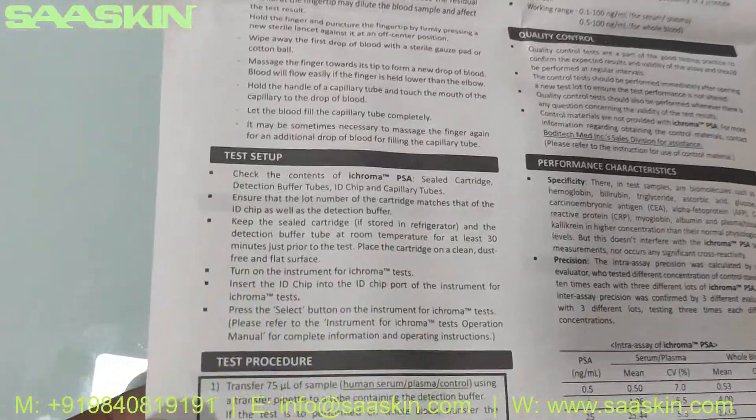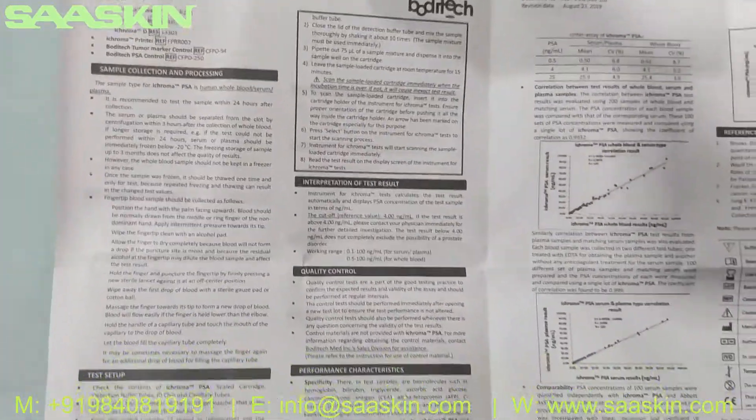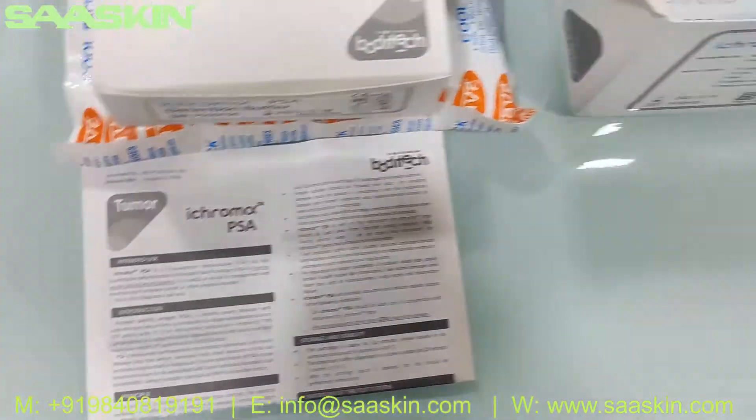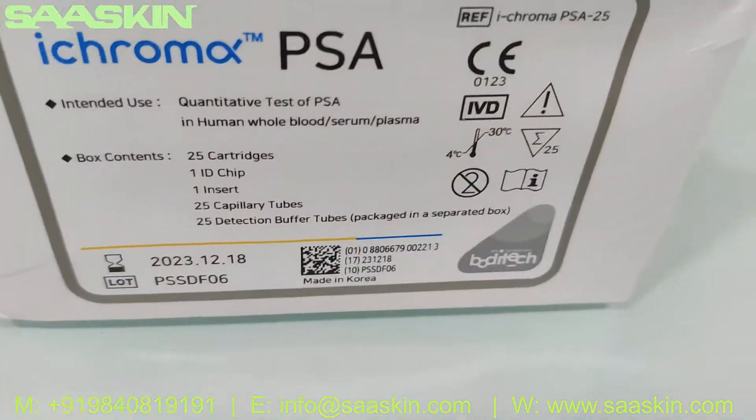The manual covers how the sample collection process and test setup works, and then the interpretation of the test results. A complete insert guide is given here. You can also see that this is a CE-certified kit.